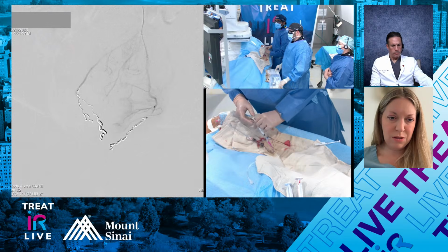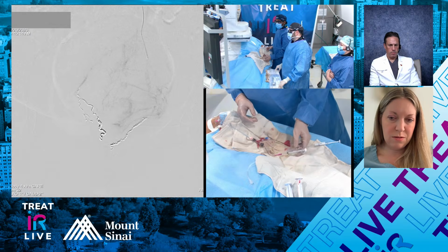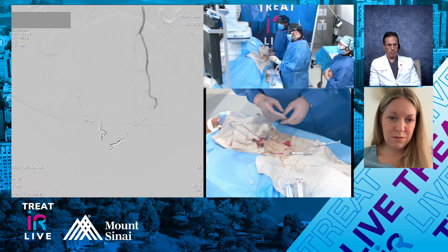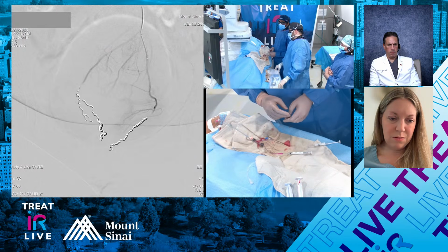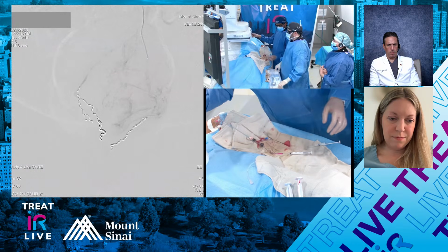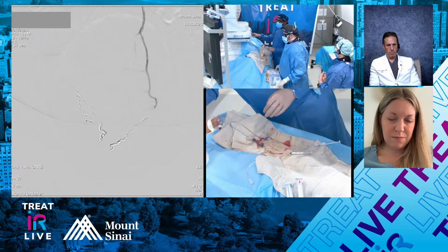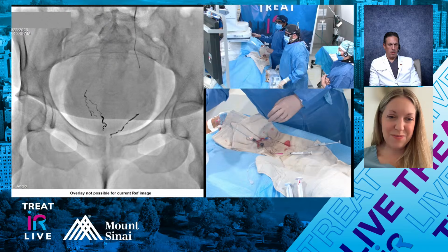One nice thing, on our initial puff after we placed that second coil on the left side, you can see the very superior end of that second coil is kind of going into that other branch that was feeding. Initially, we saw flow there, and I was mentioning whether or not we should drop another coil. We decided, and by we, I mean Jay, decided to give it 60 seconds, and it immediately took care of it and nothing else was necessary. Sometimes you need a little time.